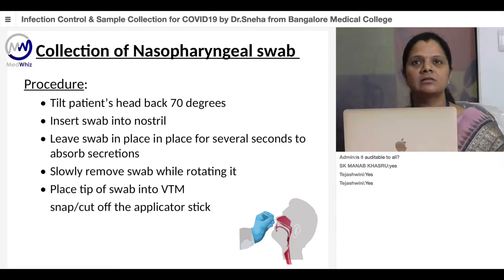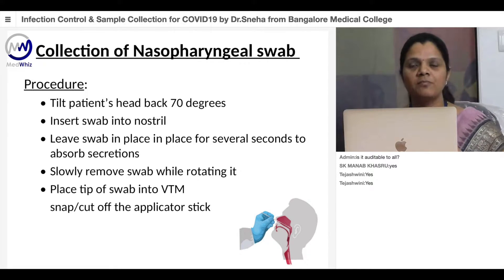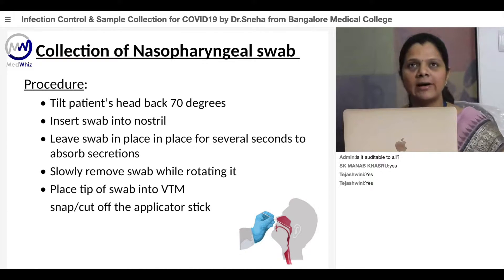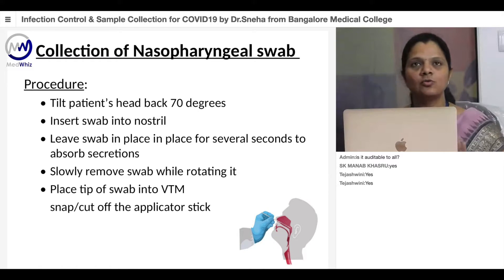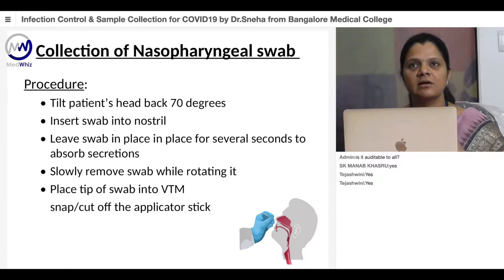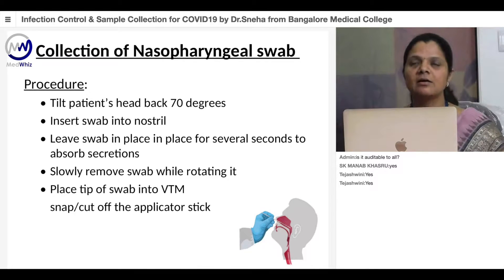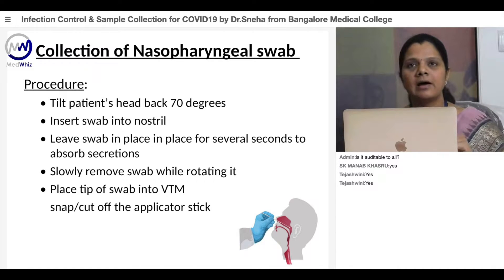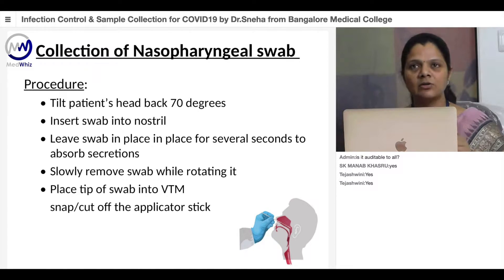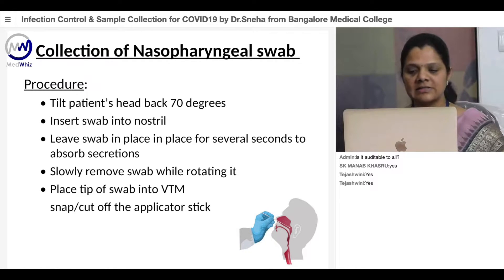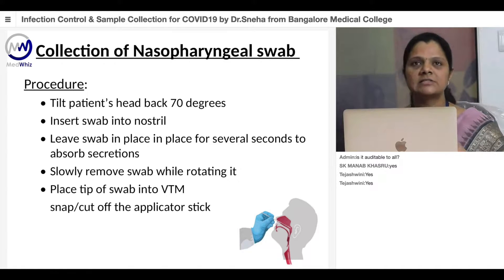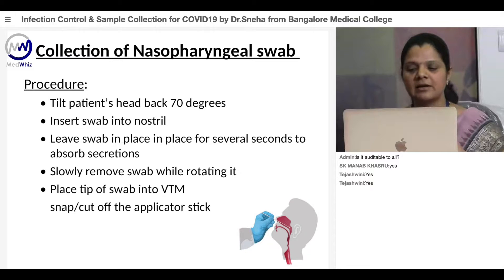Having worn PPE, put materials in place, and filled the SRF form—which generates a unique SRF ID important for tracking the patient—we should proceed to collect the sample. For the nasopharyngeal swab, make the patient sit on a chair, make them comfortable, and explain the procedure. Ask the patient to tilt backward to about 70 degrees and insert the swab along the floor of the nose carefully. The approximate length can be estimated as equal to the distance from the tip of the nose to the earlobe. Leave the swab in place for several seconds, then slowly remove it while rotating, and place it into the VTM. Cut off the applicator stick and close the lid.